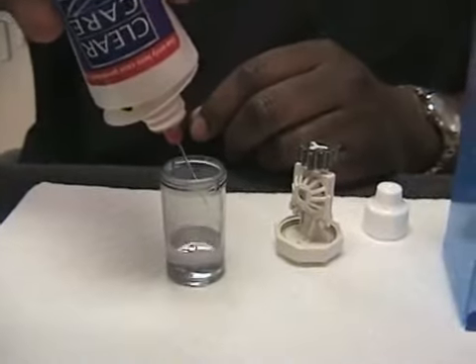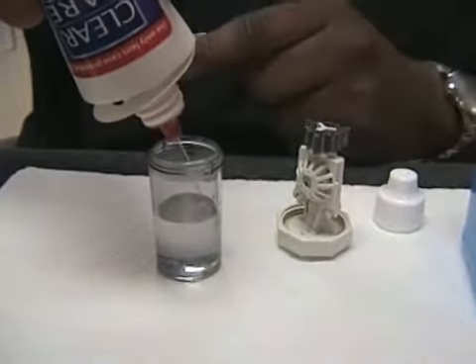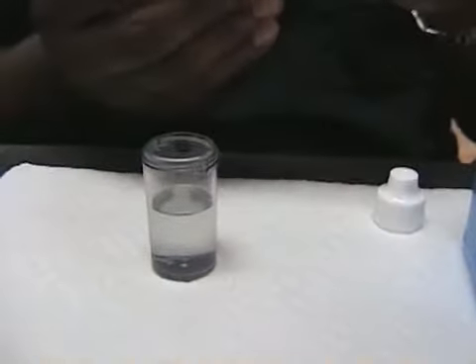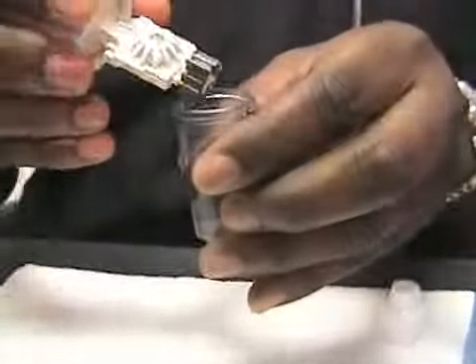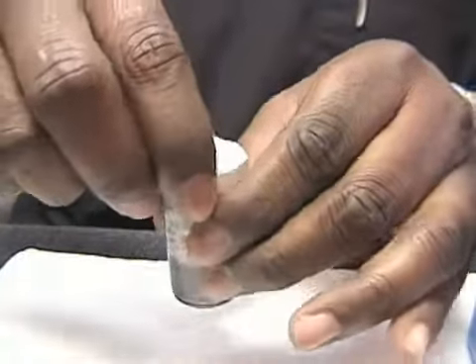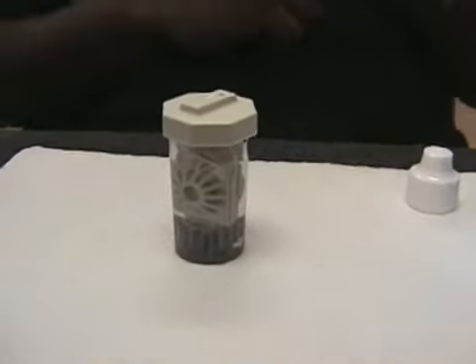Now, what's going to happen is this solution is going to react with this disc right here. It's going to foam and fizz, and it's going to do its little effervescent thing there. But you're going to take the contact lens and put it directly in the case, close it up. Make sure that you put it by the sink. This disc is going to react with this solution. It's going to foam and fizz. See the little action there?